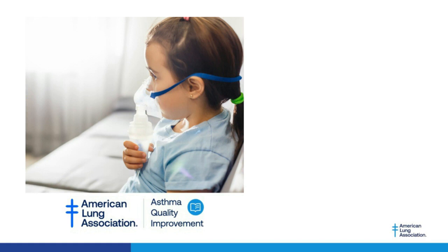We're not taking off our masks or anything, even if we know the patient is COVID negative. There are false negative tests and false positive tests, and there's a very finite window for when the testing needs to be done, usually between 3 and 7 days after infection for the PCR test to become positive. So what could happen is the patient is slowly building up the virus in their body. You could have tested, and 48 hours later the patient has a negative COVID test, but 48 hours after that, they might be shedding virus.